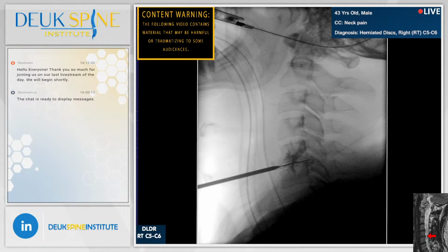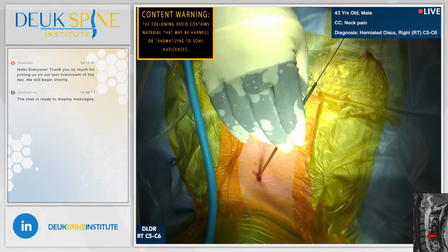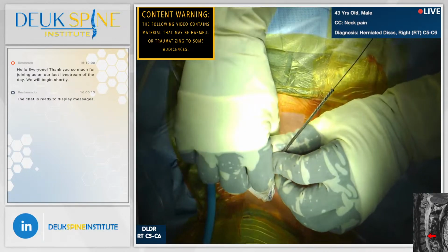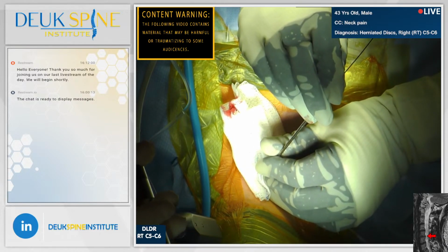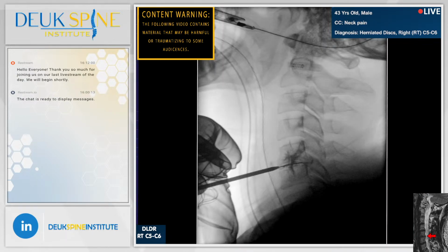All right, great. Everything's looking good. You guys see this? Yep, perfect. So the tip of the dilator, Luis, is sitting in the front of the disc at C5-C6. I'm going to pull the guide wire back a little bit because I don't want it going any further forward. Perfect. Now you agree we're at C5-6, correct? 2, 3, 4, 5, 6. Yes, all right, let's get an AP. Make sure we're in the middle of the disc. I need a Kocher.